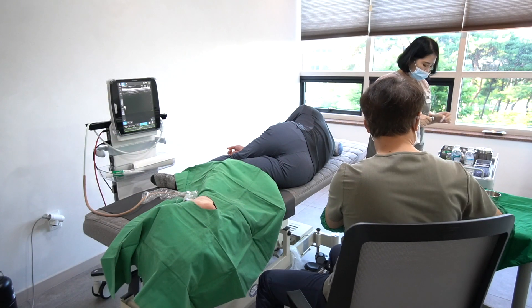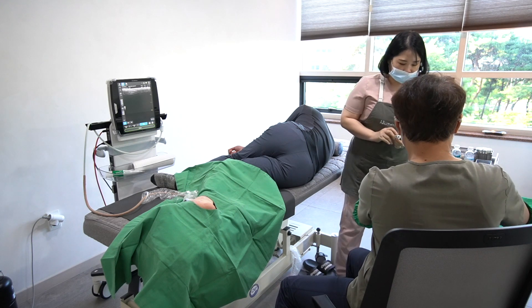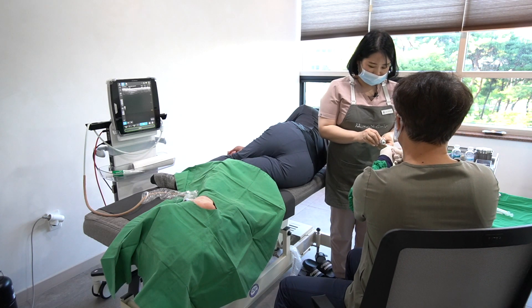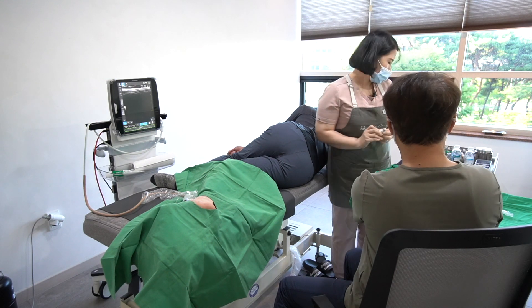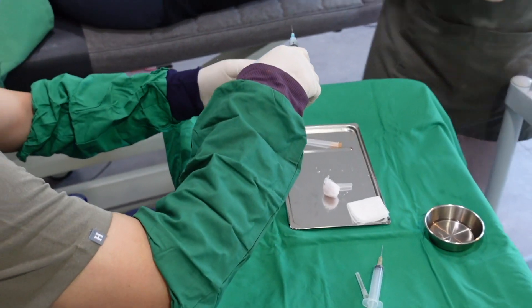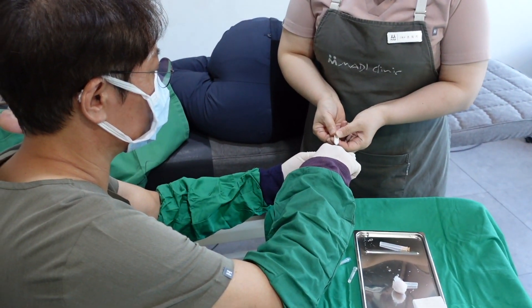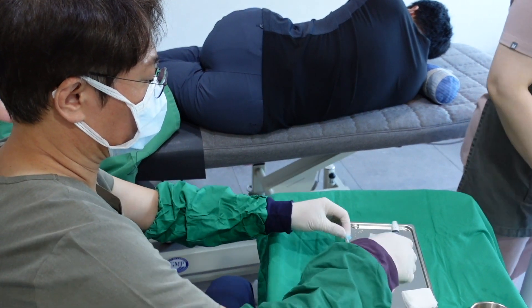While waiting for the local anesthetics to work, I will prepare the solutions for the plantar fasciitis injection treatment. I draw 1.5 ml of 30 units of botulinum toxin and 0.1 ml of 0.35 mg of dexamethasone palmitate.